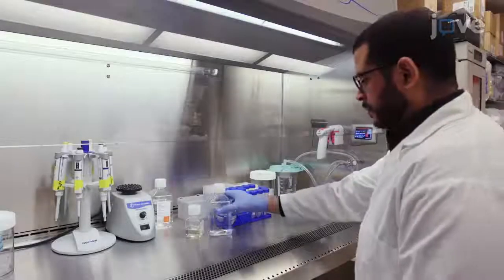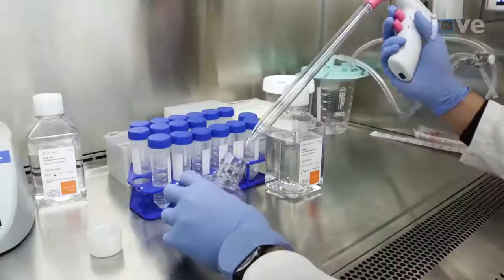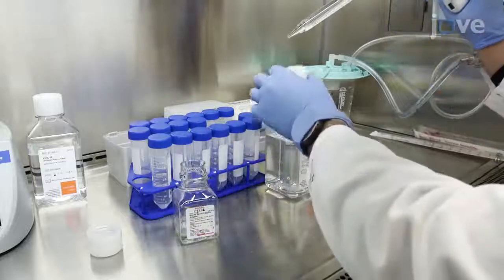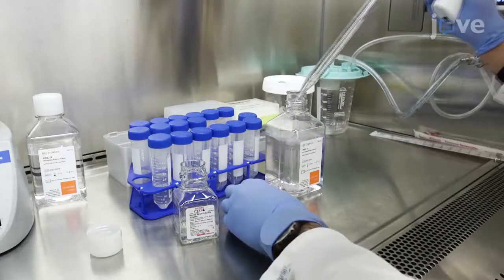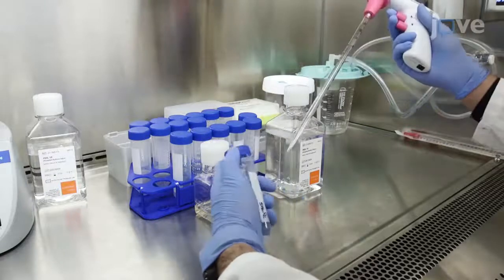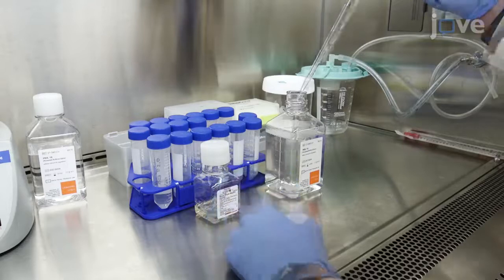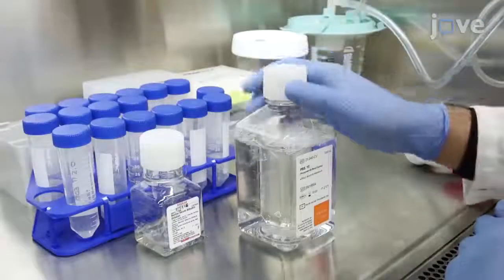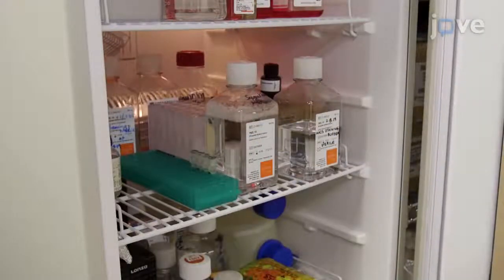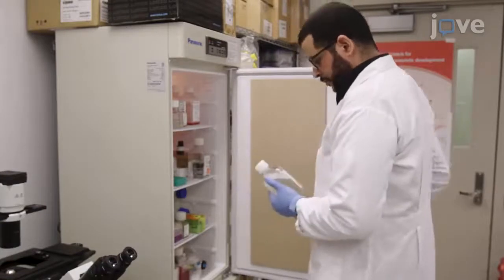24 hours prior to the isolation of CD34-positive cells from umbilical cord blood, prepare the separation buffer by adding 2 milliliters of 0.5 molar EDTA and 33 milliliters of 7.5% BSA to 465 milliliters of 1x PBS. Mix the buffer gently and maintain it overnight at 4 degrees Celsius. On the day of purification, warm the media to room temperature.